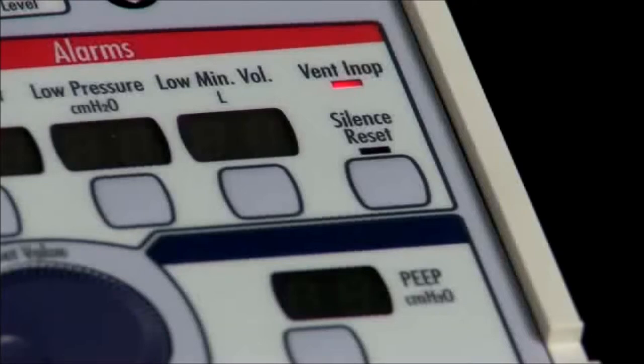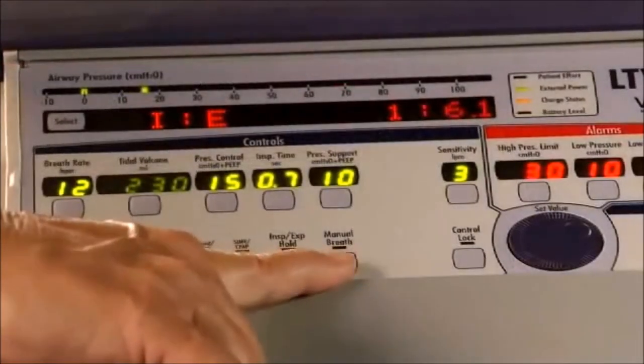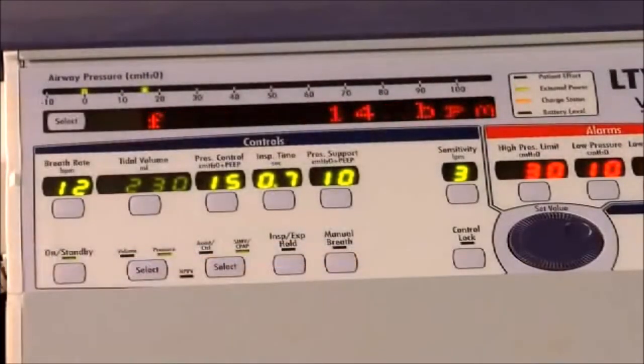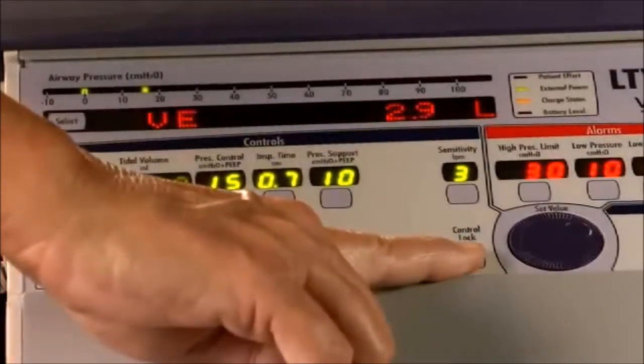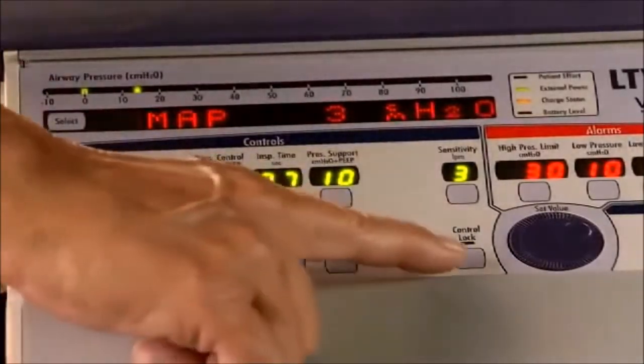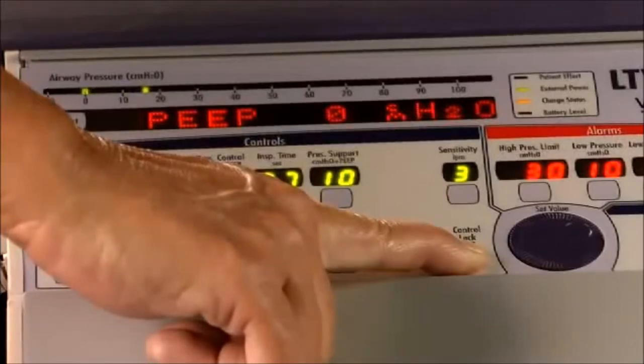This lets the caregiver know that the ventilator was turned off within the past few minutes. This is the manual breath button. Pressing this button will deliver one manual breath. The next button is the control lock. Pushing this button will lock the front panel controls so the settings are not accidentally changed. To unlock the control panel, it is either a one-button push or a three-second hold. One of the two different levels of difficulty can be set for control unlocking: easy (a one-button push) or hard (a three-second hold). The setting for easy or hard unlock can be changed by a qualified clinician.